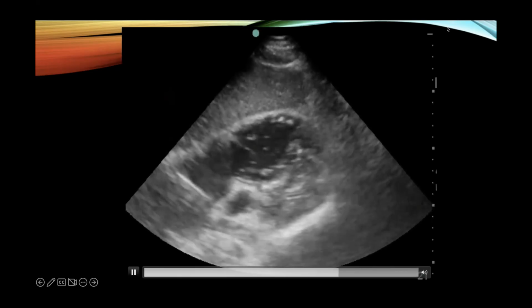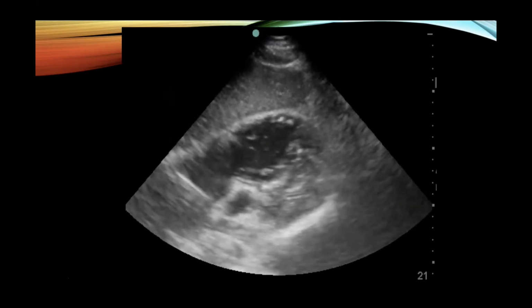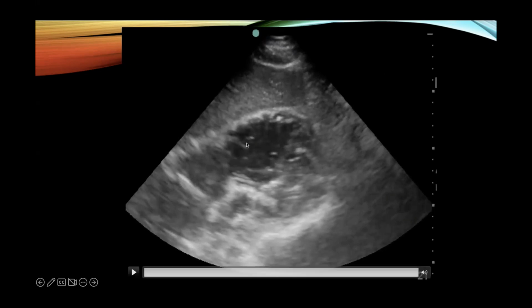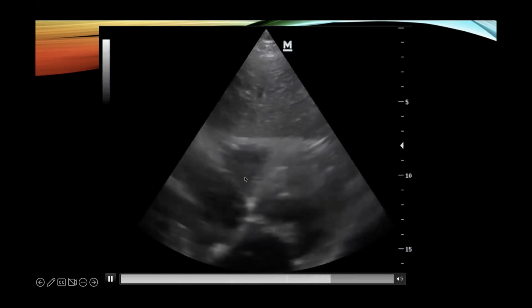Who's next? Okay, Robert, what do you think about this one? Pretty similar. There's no good contraction, and it's just maybe some specific area firing, but no organized movement. Perfect. And what about this one?